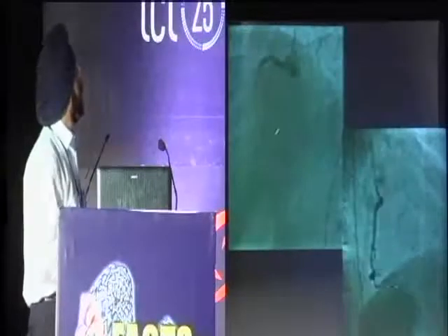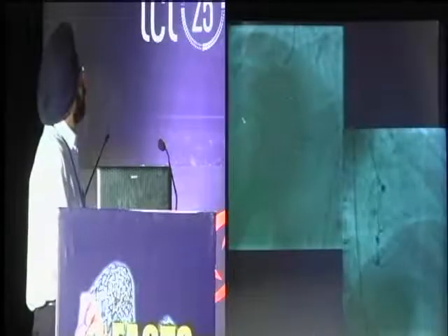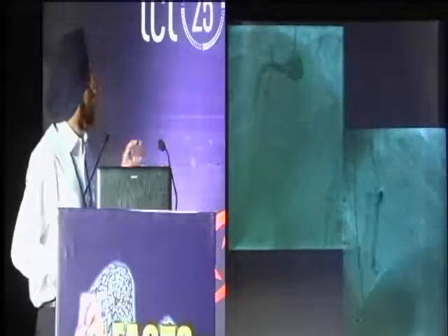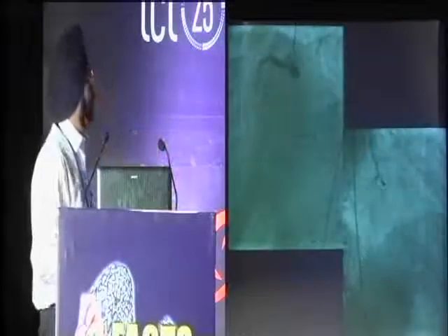Obviously this was created because now this is a major perforation. You can very well see that there is a lot of staining outside, and perhaps this was the channel which was giving a whiff, and it could have led later on to a catastrophe. Important point, as compared to the previous case, where I could dare to compromise on the vessel, here you cannot think of compromising the vessel.